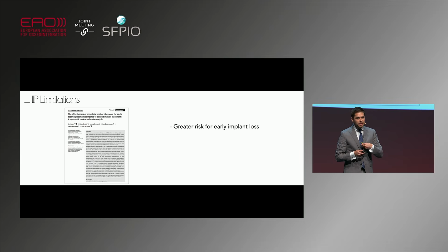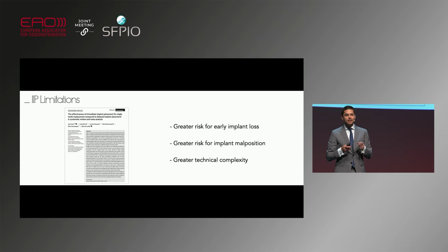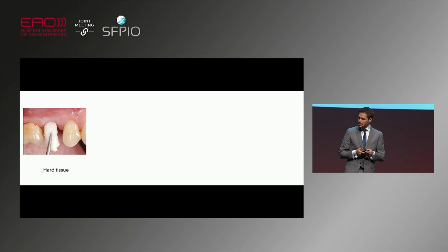And then I added, and this is me, this is not the paper, saying that obviously there is a greater risk for implant malposition. This is particularly if you go freehand. If you use a guide, then you will not have this problem. But also I have to tell you there is a greater technical complexity, and this is particularly if you do an immediate loading procedure. You have to control for the occlusion, you have to have the implant having enough primary stability, and the procedure becomes more complex.